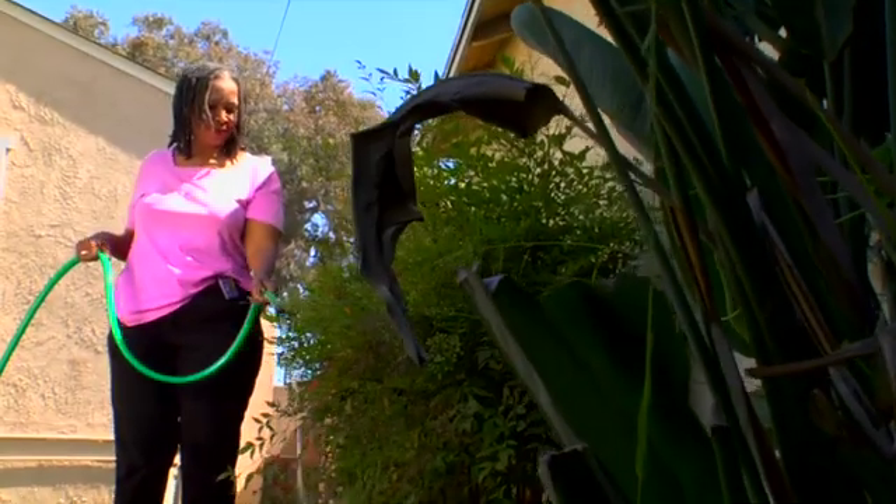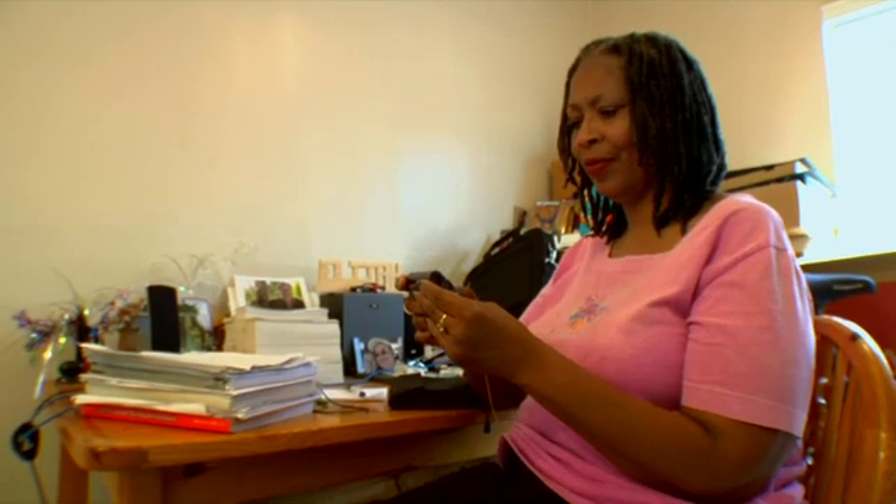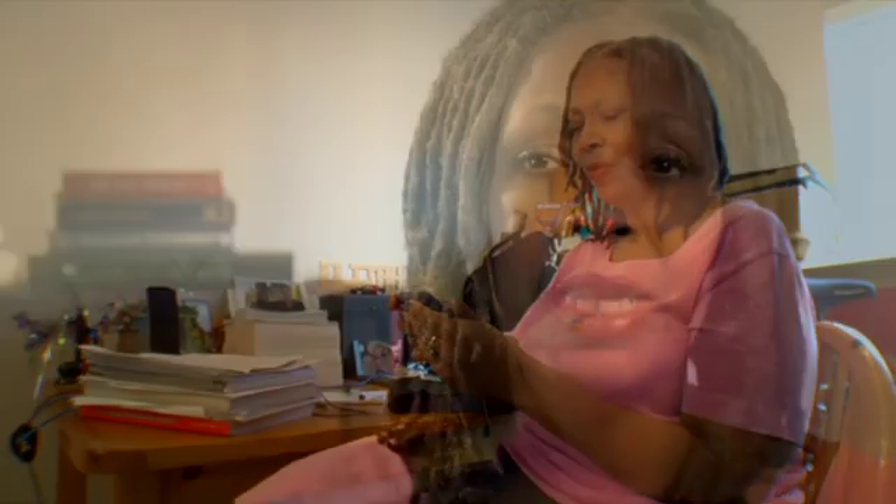I like the MiniMed because, for one thing, it is small — it doesn't take up a lot of space. I can wear it in more than one place on my body, and above all, it helps me keep my sugar at a more normal level.